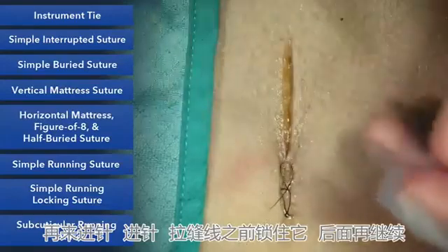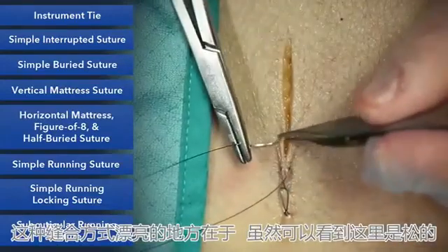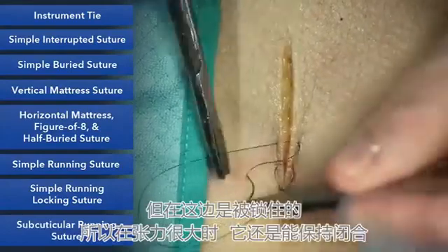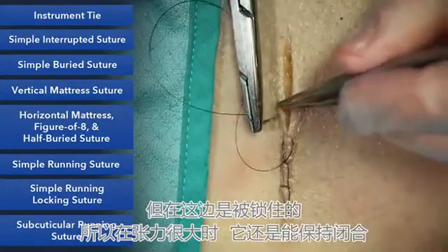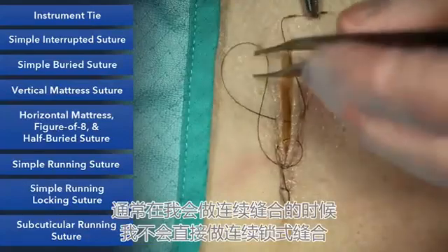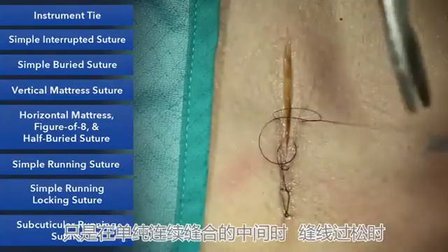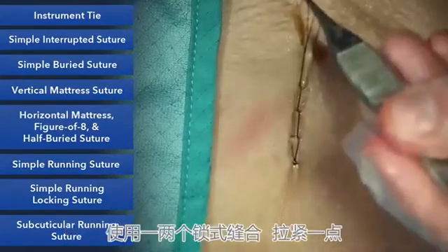And you can go on from here, and the beauty of this is that you see, although it's loose here, it is locking back here. And so when you're under a lot of tension, especially, it'll hold for itself. Now sometimes I'll do a running stitch, and I don't plan on doing a running locking, but at some point in the middle of the suture it starts loosening on me, and then you can just throw in one of these locking sutures. Always keep it nice and tight.